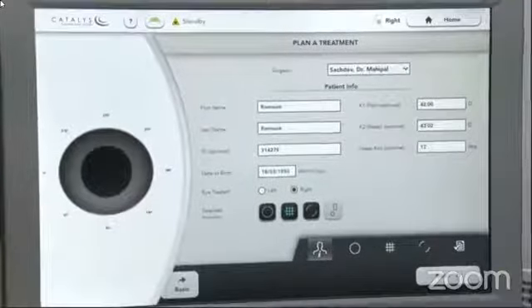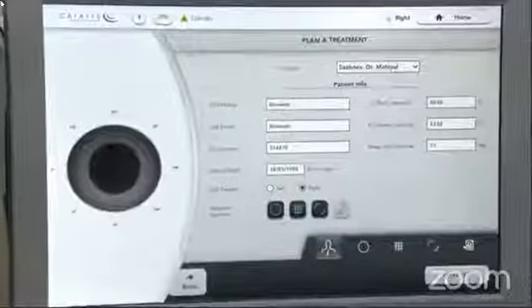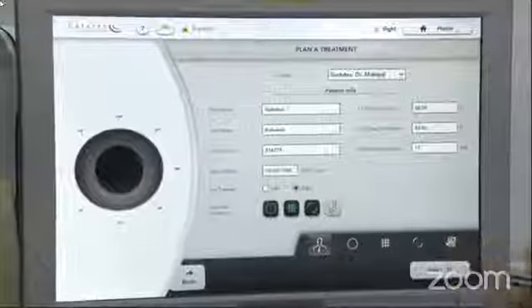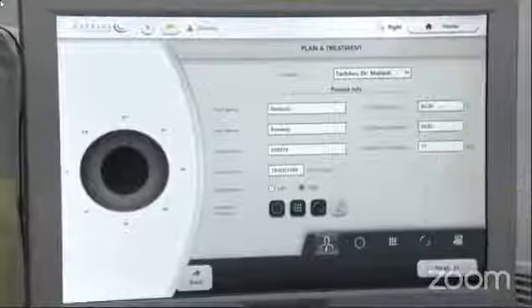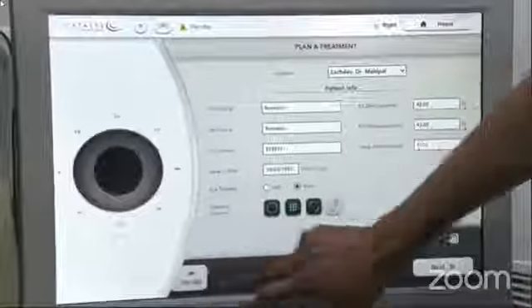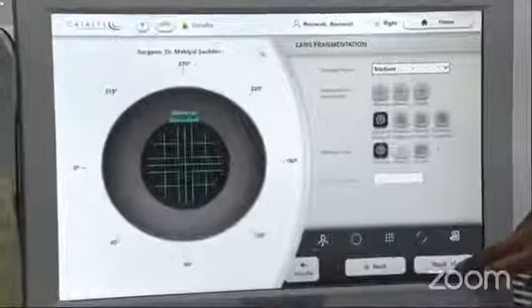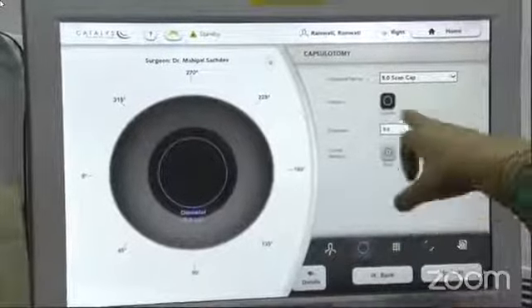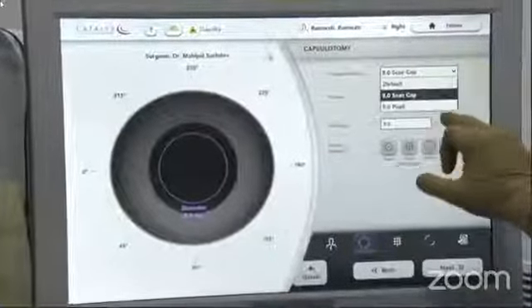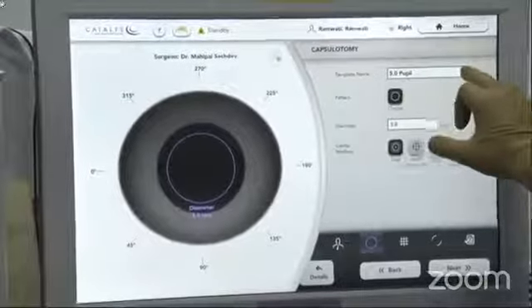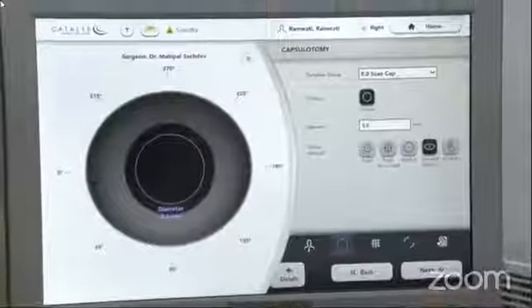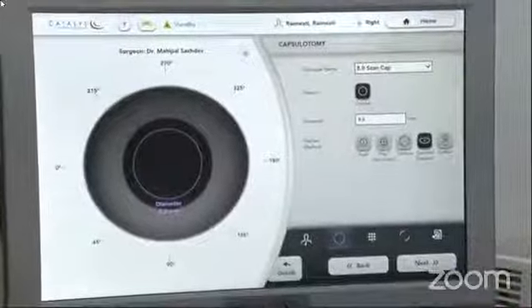What we have to do with the Cassini — which is like a pentacam — is that you take the steep axis and feed it here. The steep axis is 17 degrees, which you have fed in. We have fed in a capsulotomy of 5 millimeters, and this is the scanned capsule. You can change it from scanned capsule to pupil, or do it manually. In this case, we will be scanning the entire capsular bag and placing the capsulotomy at its center.